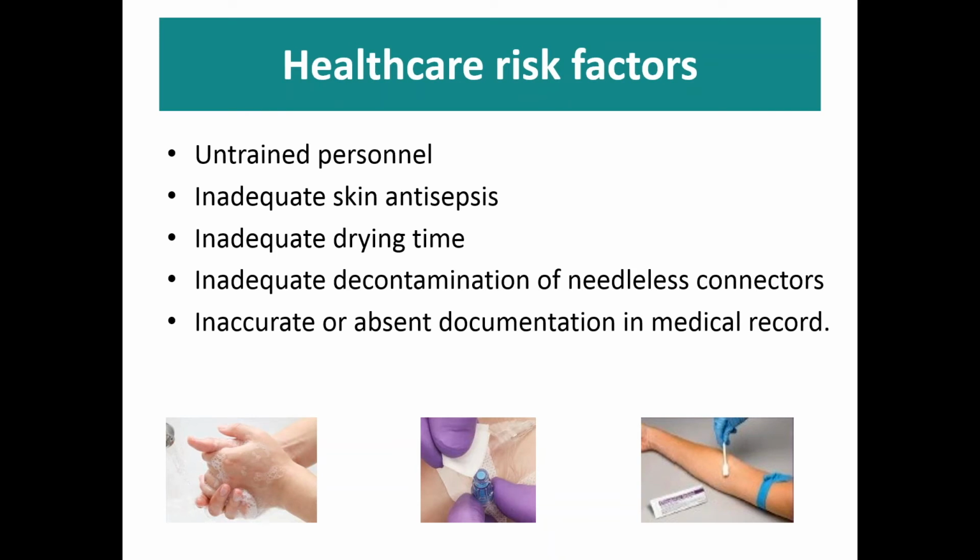Improper disinfection of needleless connectors can result in contamination of the internal lumen of the catheter with bacteria, resulting in the formation of biofilm and potential for bloodstream infection. However, unfortunately, the best antiseptic and technique for disinfecting needleless connectors is still being investigated. And documentation being inaccurate or absent from the medical record is a problem because it makes it difficult to track the infection back to the catheter, and catheters get missed when they're not documented.